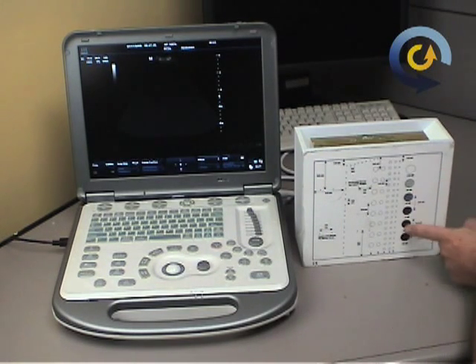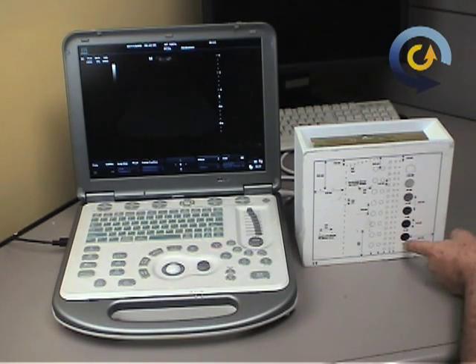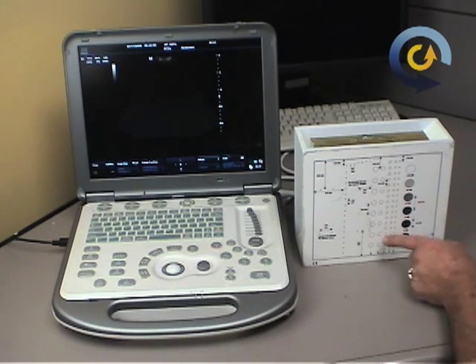Contrast resolution is what you can see right over here. It wants to find out how well you can see changes in density, not just a change of size of an object. There's only 6 steps across here, but you can actually watch it go from being able to transmit all the echoes through it, it'll be perfectly clear, to passing the echoes and not being able to see those on the bottom. And you want to be able to see that you've got nice gradation through here. These are the same size.